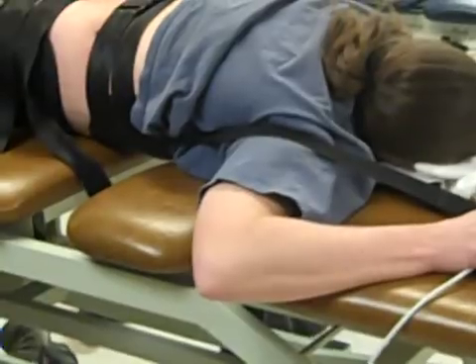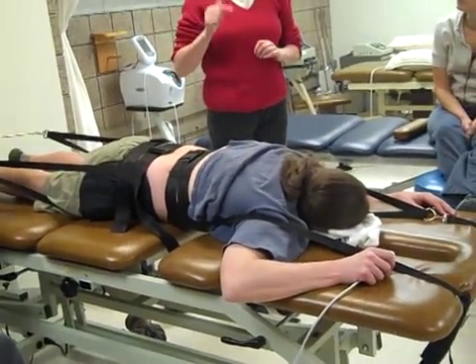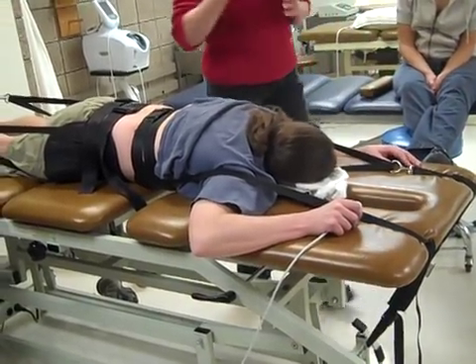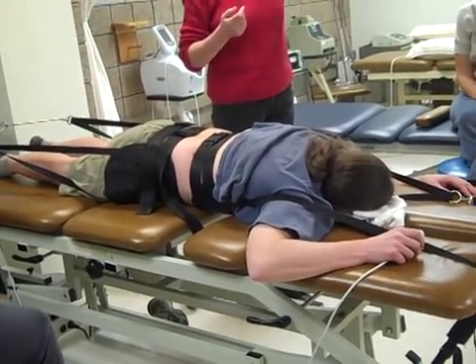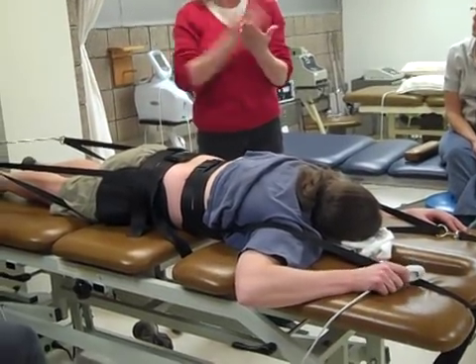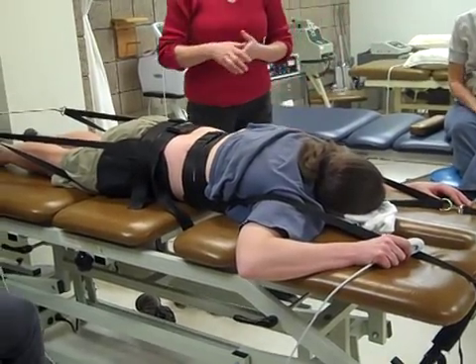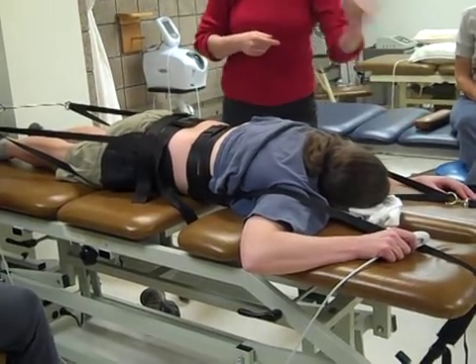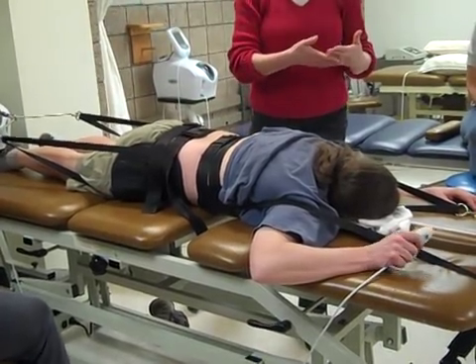Okay? And the other thing is, when you come for your skill check, I expect you to have these belts hooked to the table and semi-ready to go. And that's what we would do with our patient. If we looked at our patient caseload in the morning and we saw that we had to do traction, first thing I would do, go out, get these upper belts on, get them hooked to the table. If your skill check is cervical, you just whip them off and throw them on the floor and hook up the cervical part of it. But then you have that already hooked up.